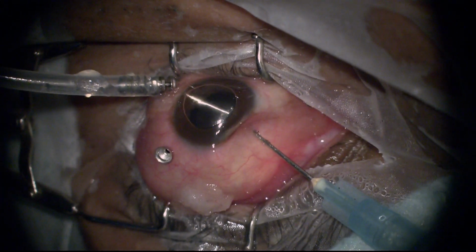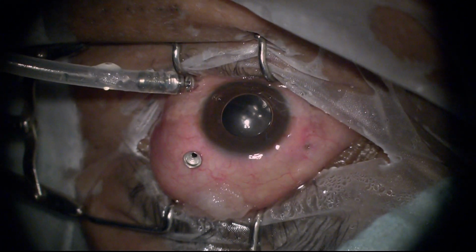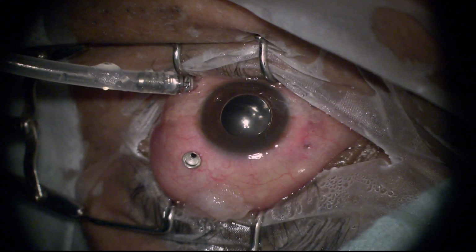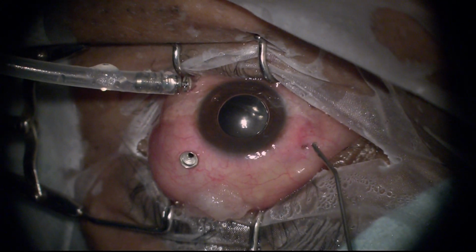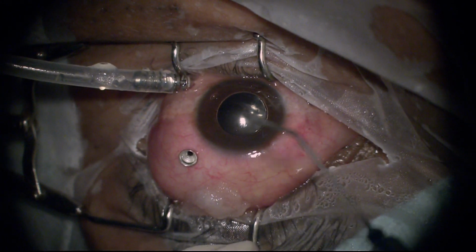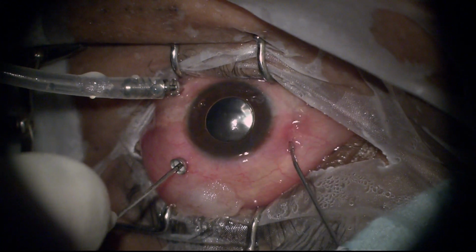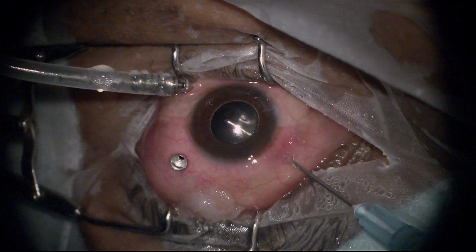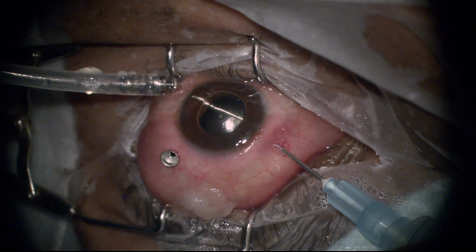At times you can have a situation where the iris is sticking to the cornea and this doesn't get relieved easily in spite of injecting an air bubble, and at this moment it is possible to ensure that the anterior chamber is formed by putting in some viscoelastic in the space between the iris and the cornea. Although this may sound like it may cause some post-op rise in IOP, but believe me, it is important. Otherwise, if you don't make this anterior chamber right now, it will inevitably lead to severe secondary glaucoma, because the access to the angle is blocked by the adherent iris.